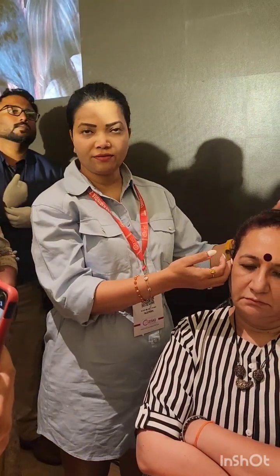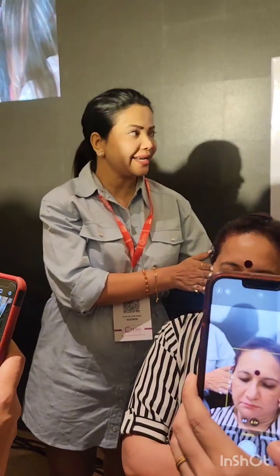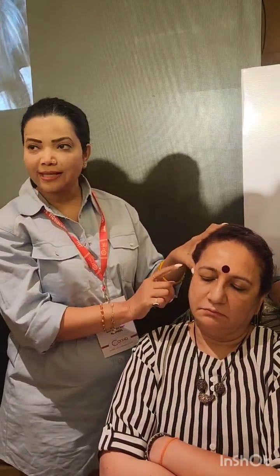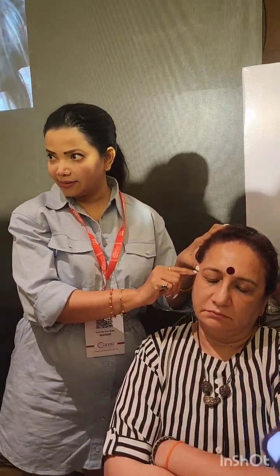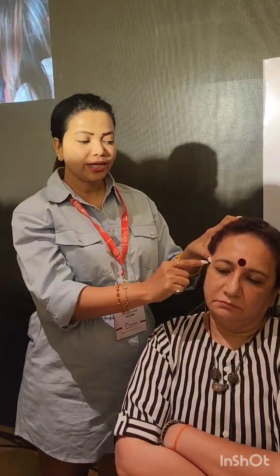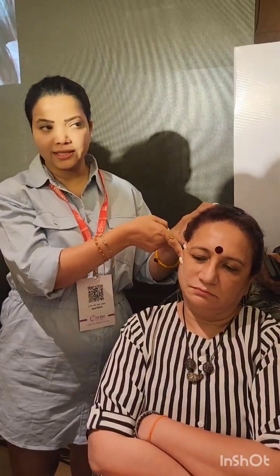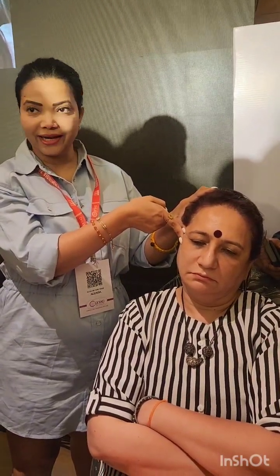So here for the midface we use the zygomatic retaining ligament, which is over the zygoma. So there we anchor our thread, so it gives support. The ligament is a very tough structure. You incorporate your threads into that, so it doesn't move from here. So that is how it lifts. That is how it gives you a vector of force, right?